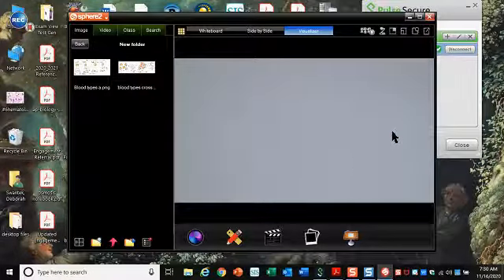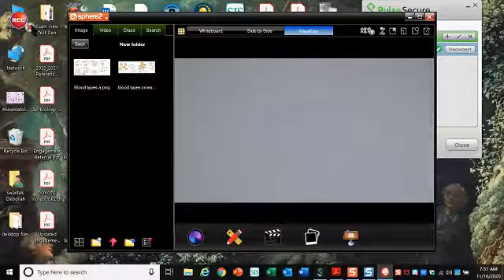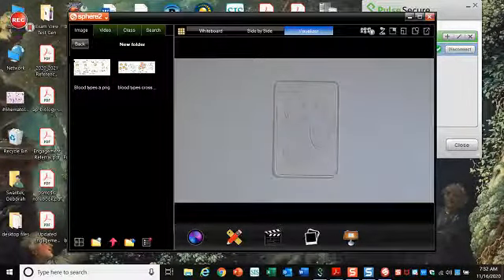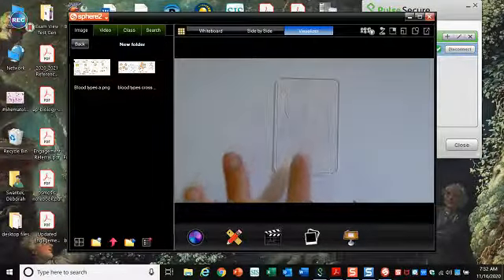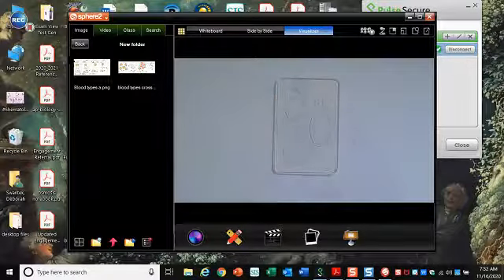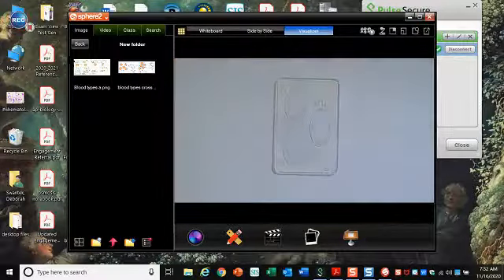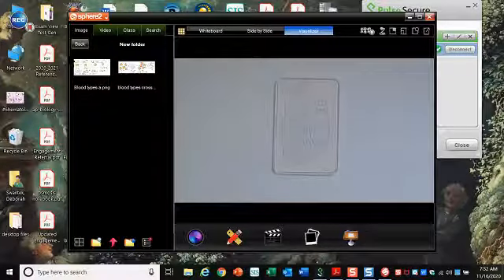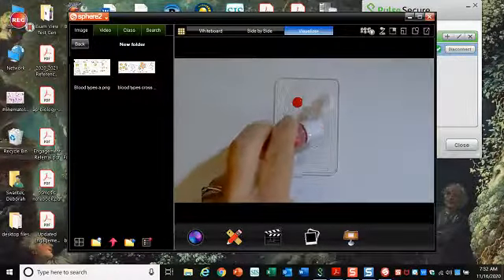So we're going to start off using these trays, and the spaces in the trays are called wells. You can see it says A there, B there, and RH there. Okay, so I'm going to take sample 1. Going to shake it up because I want my blood to be a nice homogeneous mixture. And I'm going to put 1 drop of blood in each of the wells.